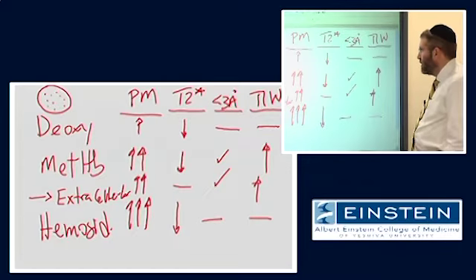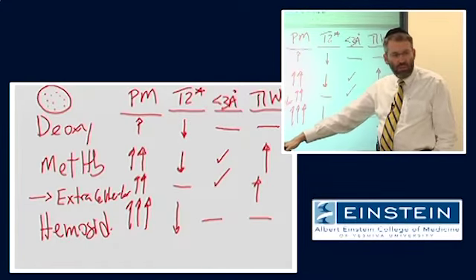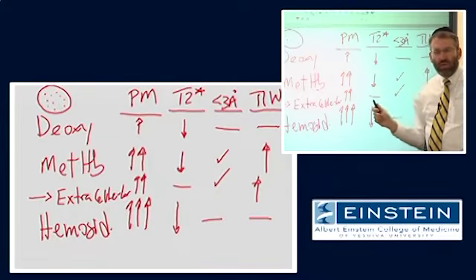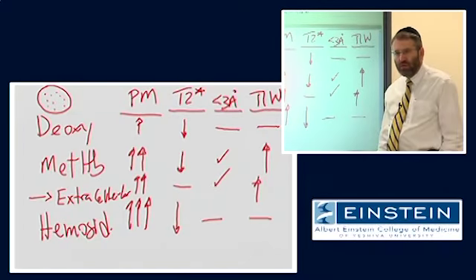So by understanding at a molecular level what's going on with the hemoglobin and how these 2 characteristics of this paramagnetic stuff interact with our signal, you could reconstruct this yourself.